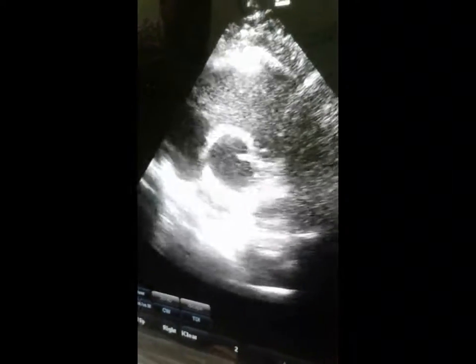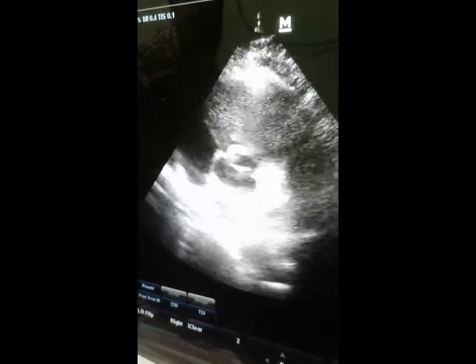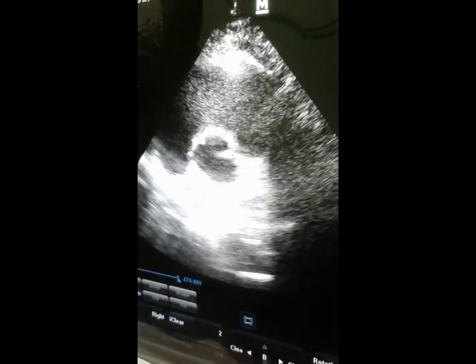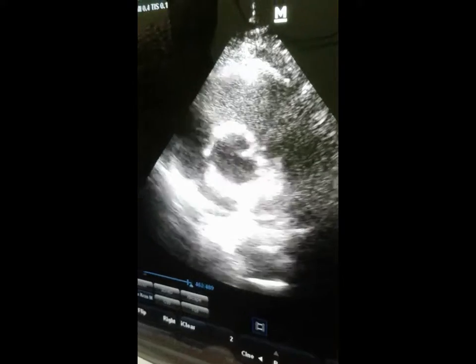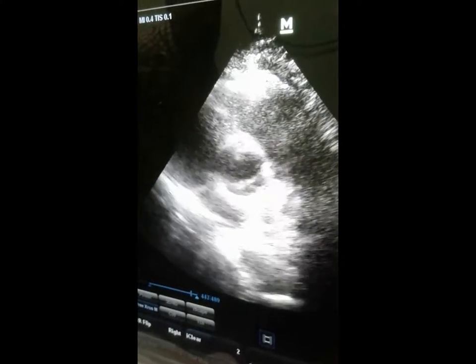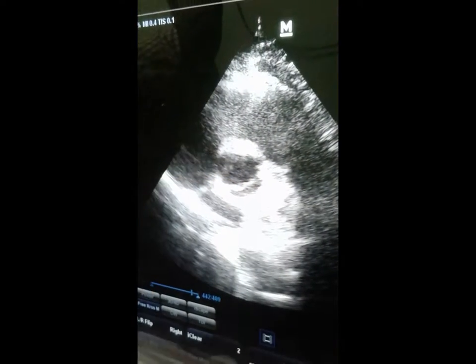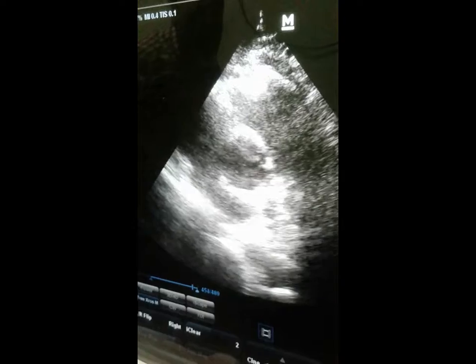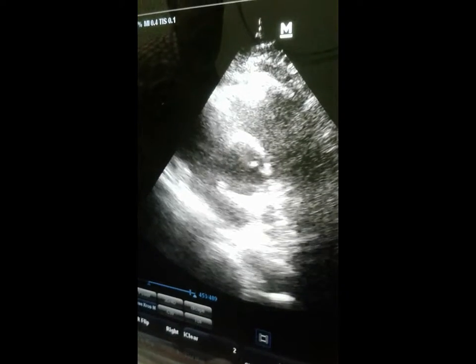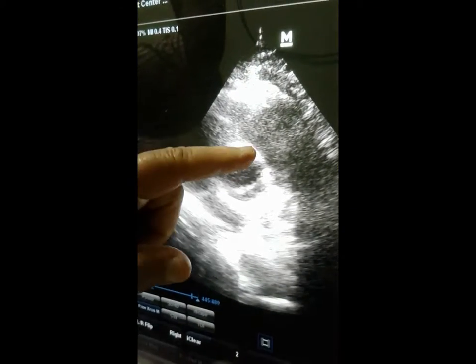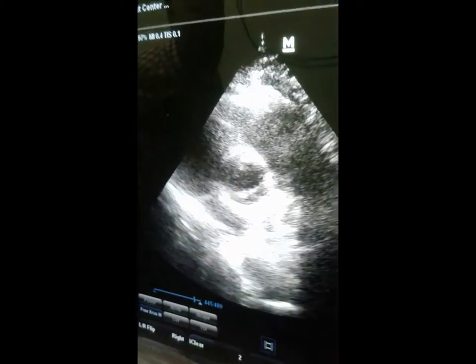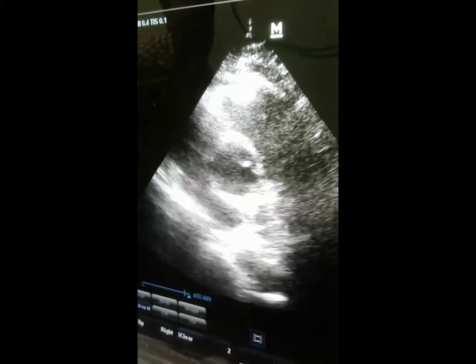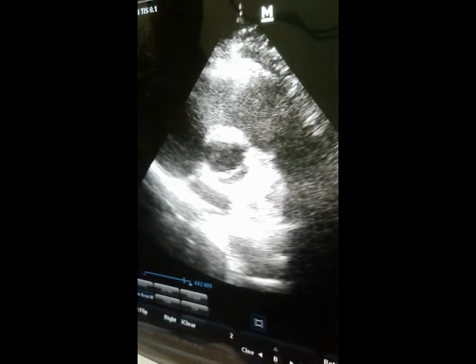But with bicuspid aortic valve. Look here — both cusps close eccentrically and open like this. Bicuspid instead of triple cusps.